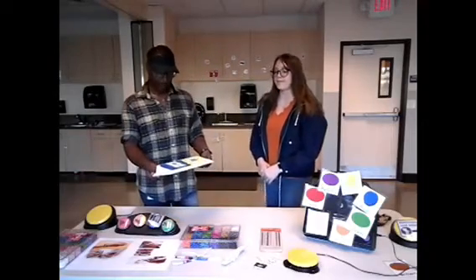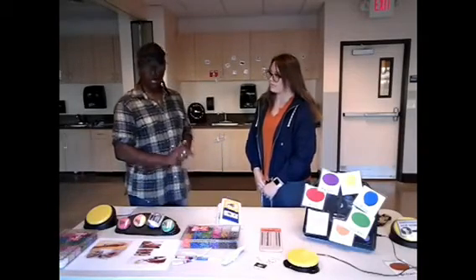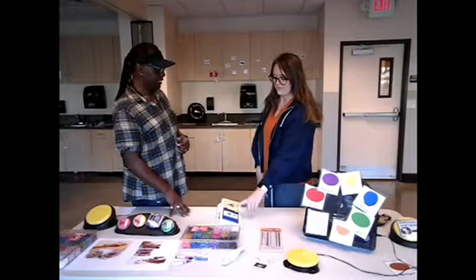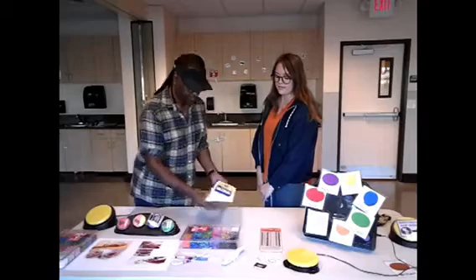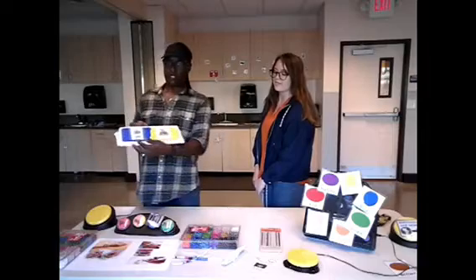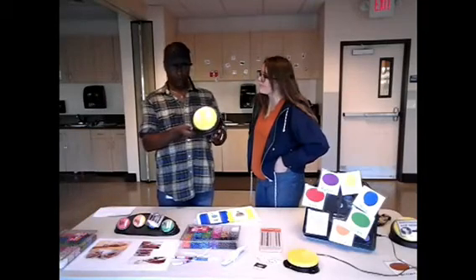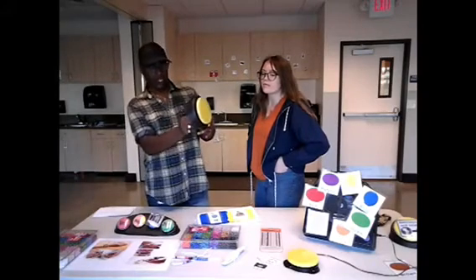So if we're at a lunch table, and I set this in front of Cassidy and she wanted to have communication and she didn't talk, we could have engagement between the two of us. I could ask her, is there anything you would like for lunch? And if we set this up based on what's for lunch, like say we're going to have juice or some kind of liquid, I could program this one to say drink, and I could program this one to say lunch. Big Mac can be programmed to say whatever you want for the consumers.